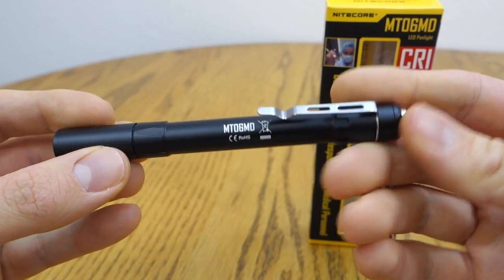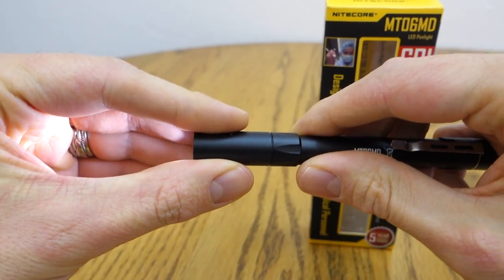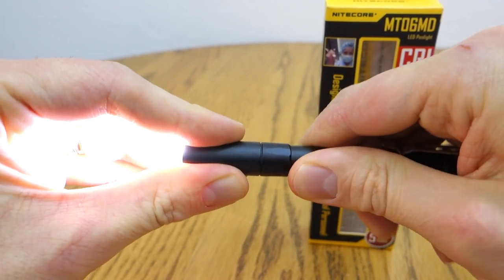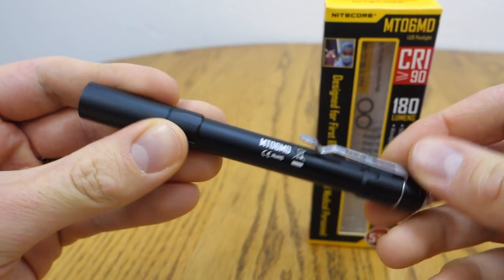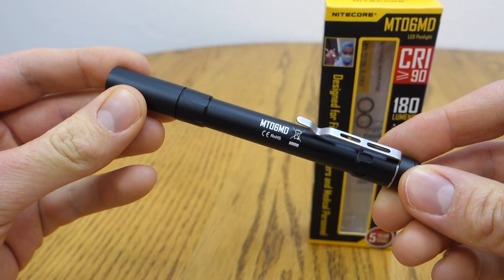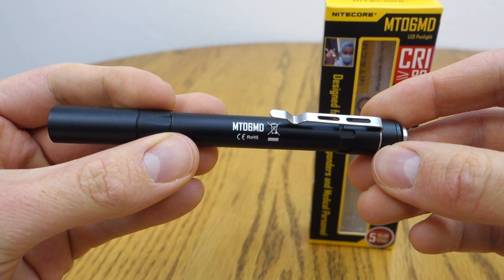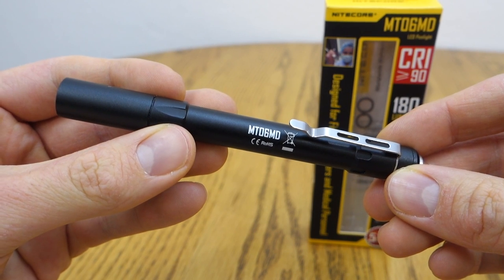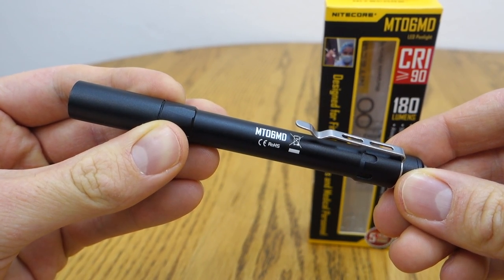Since it's a pretty simple system, you can actually use the bezel connection as well. If you loosen and tighten it kind of quickly, it'll cycle through the modes. Suffice it to say, there are no hidden modes — just three levels. I'm not sure who would need a strobe for a simple pen light, and since this is geared for doctors, I don't think they wanted any of those popping up while looking in patients' eyes, so just regular primary outputs.